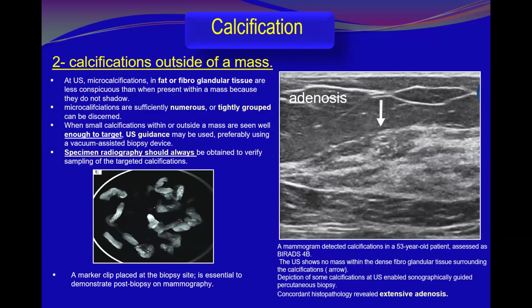It is also essential to radiograph the specimen to make sure the targeted calcification is seen within the biopsied sample. And it's also important to place a clip at the biopsy site to demonstrate post-biopsy on mammography.